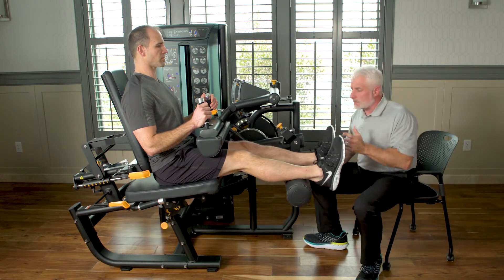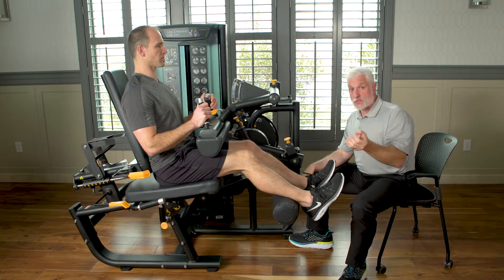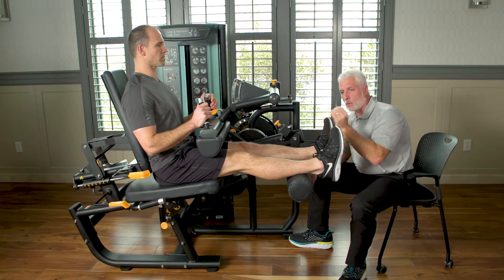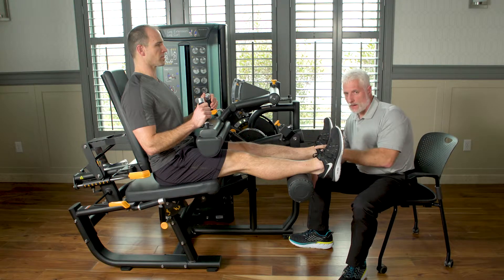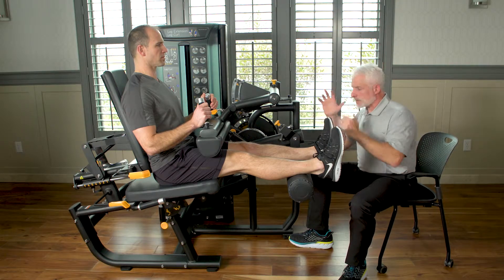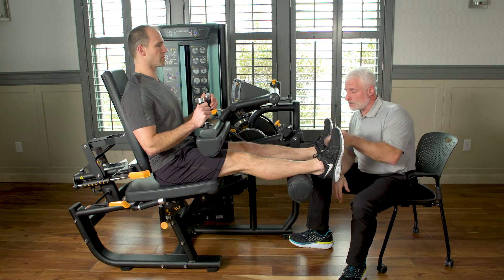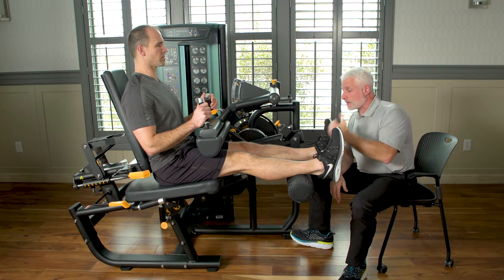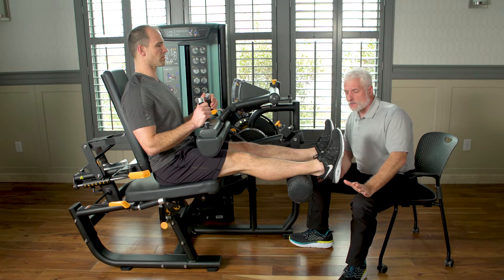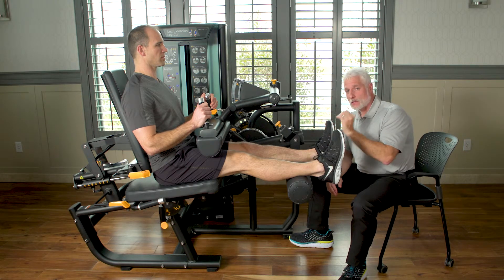If you have an ACL patient that is four or six weeks out of surgery, you need to work their hamstrings because that protects the ACL graft. In this position, pulling down from A to B, they will work the hamstring most efficiently without putting pressure on the graft. This machine lines up the axis correctly, offers easy entrance and comfort, and it's very easy to adjust the levers — patients can help themselves once they learn. I encourage you to look into this device because you can work a whole range of patient populations to gain strength, range of motion, endurance, and function.